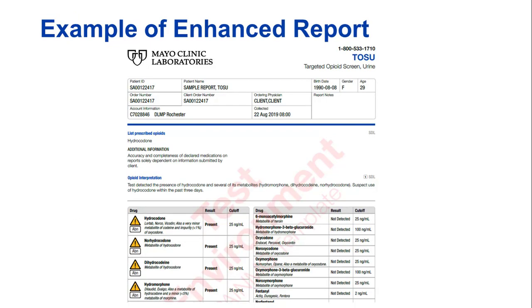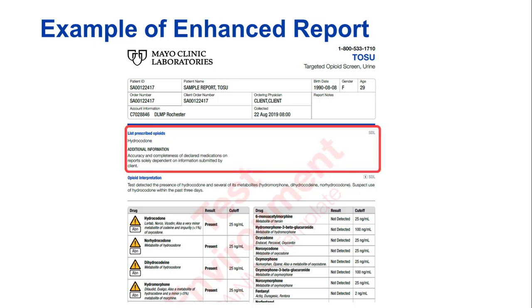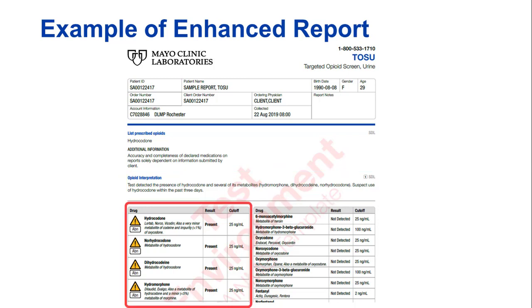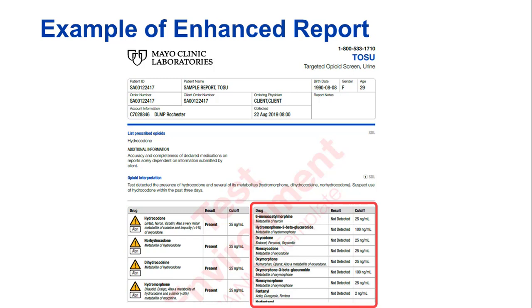This new test comes with an enhanced PDF report that has interpretive comments to aid the clinician with interpretation of the test results. Here is an example of an enhanced report. If the client has entered the prescribed opioids when ordering the test, the medications will be displayed at the top. The next section is the interpretation section where a comment is given providing guidance regarding the test results. All positive results are pulled into the top section so the clinician can immediately see what was present or detected, along with additional information regarding brand names or if something is a metabolite or possibly an impurity of another drug. The last section shows all the analytes tested for that were negative or not detected.